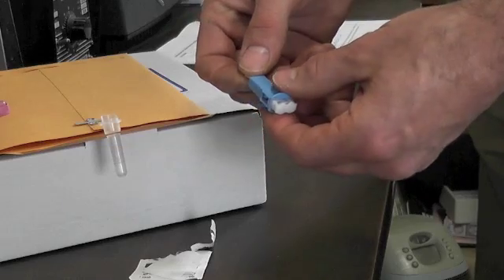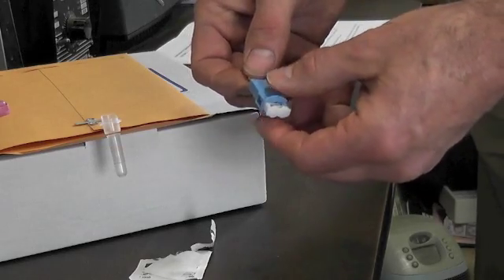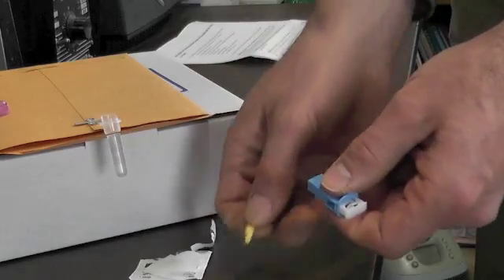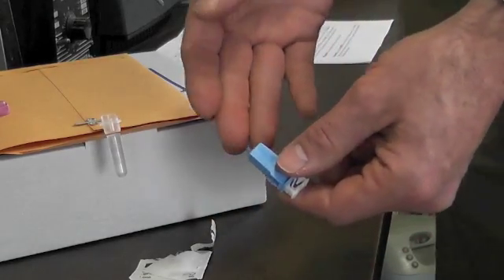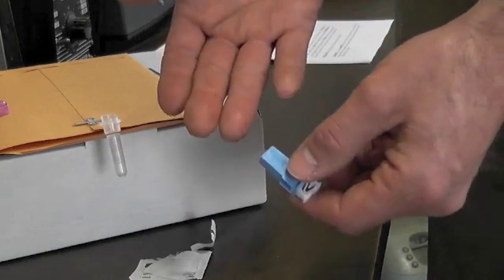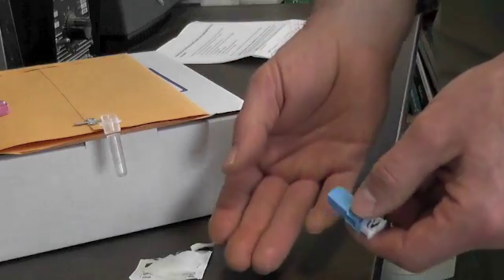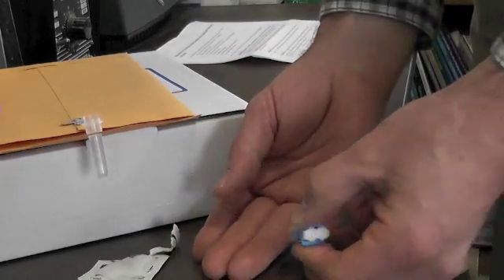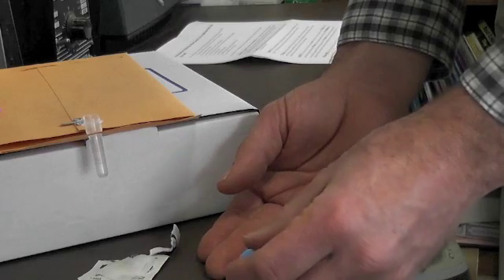Now there's a couple different lancets. One of them twists off, this one pulls straight out. This is a single use lancet, so you can't practice with it. You get one swing at it. They work really well, so you don't have to worry about it not working.